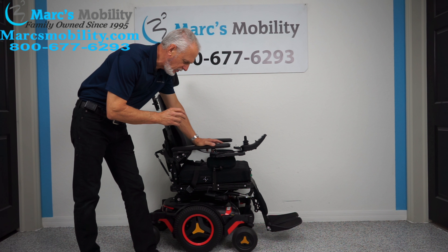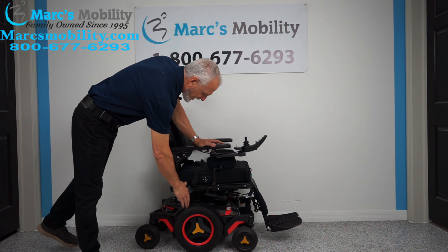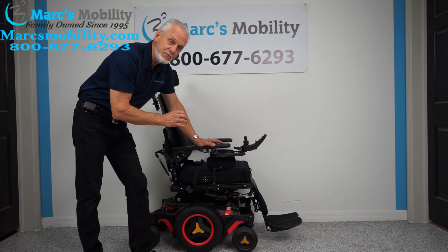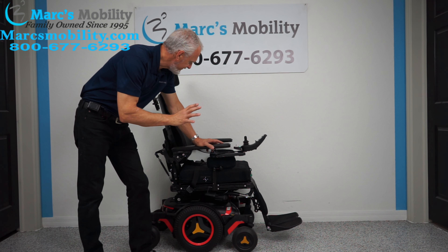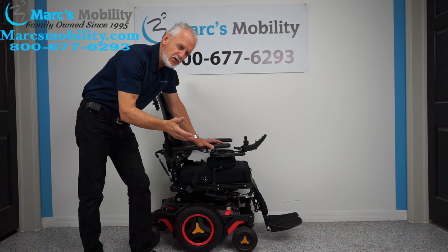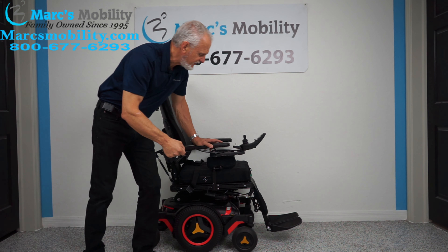We have here a Permobil M3 mid-wheel drive power chair by Permobil. This chair has 118 miles on it, which is nothing for a Permobil chair. That means this chair was used for about five months. If a person uses their chair all year round, they get about 300 miles a year, so 118 miles equals maybe four or five months of usage.